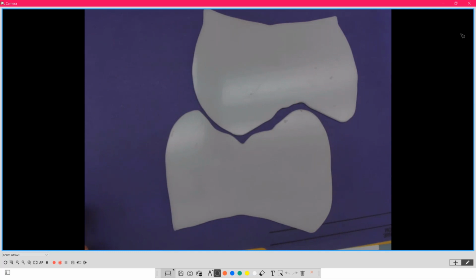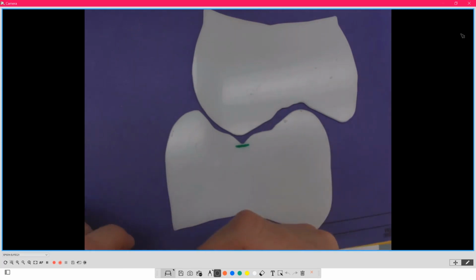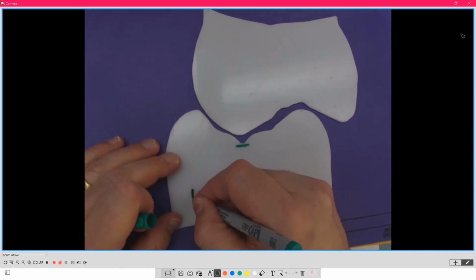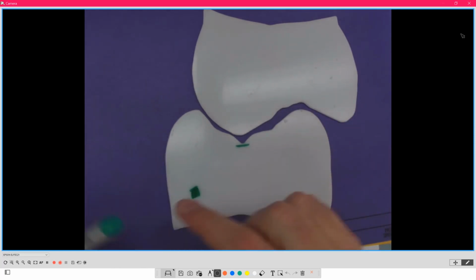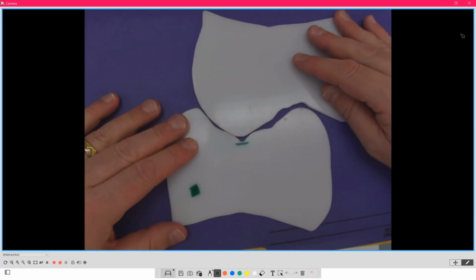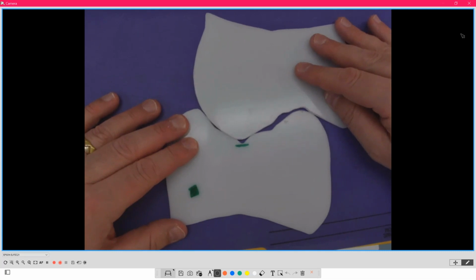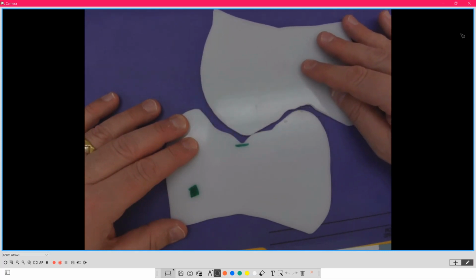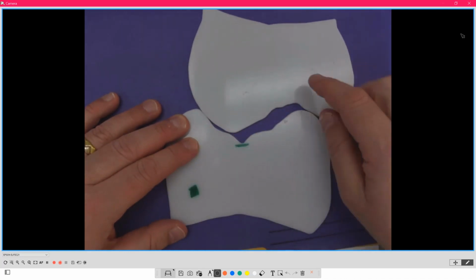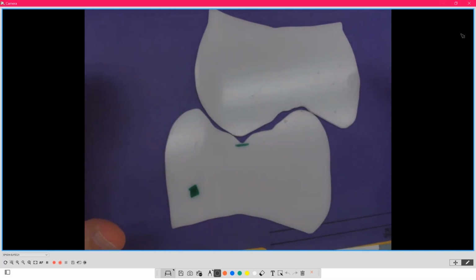Okay, so this is that little bit of freedom right in here. Out of the factory, it's about a millimeter box to work in. So the helicopter pad is about a millimeter, which means you have about a millimeter green zone to land in and move in. Now, what happens is, again, we've been building denture teeth that are quite locked together. So a standard working and balancing setup functions like this, so that there's the contact of the lingual guiding plane against the upper buccal. Everything should be hitting and contacting on the articulator with the teeth, okay?